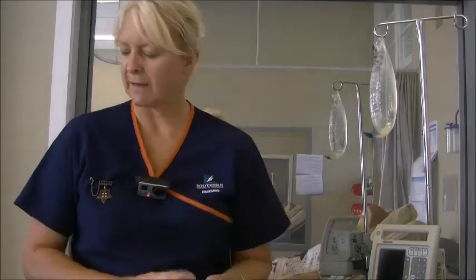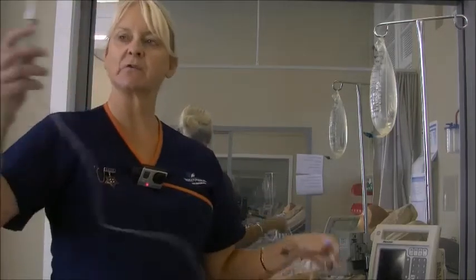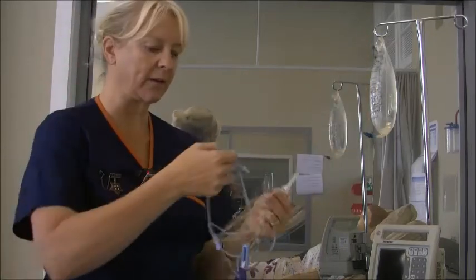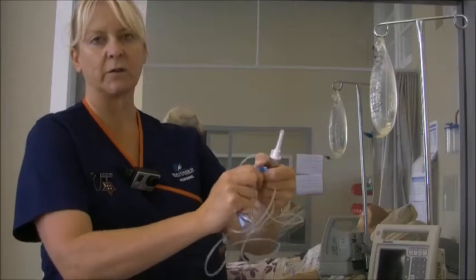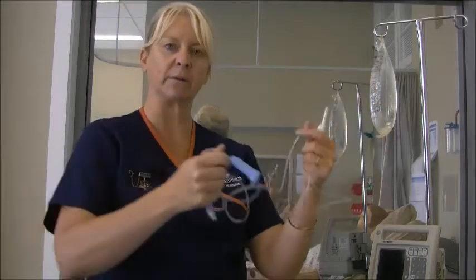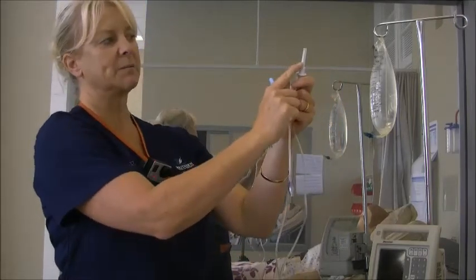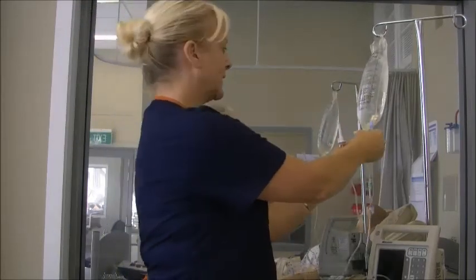Okay, so I've got my IV and my IV tubing, which I've taken out of its plastic case, and I just want to make sure that my tubing is all intact. So I'm going to unravel it, being really careful not to touch it onto anything. So making sure we've got a good hold of it, and then making sure I turn the roller clamp off, because the last thing I want to do is connect it to the bag and have all the fluid just come out the other end. So the way I'm going to do that is, these have a plastic spike cover. I'm going to take that off, and I'm going to take this plastic cover off and then connect it to the bag.